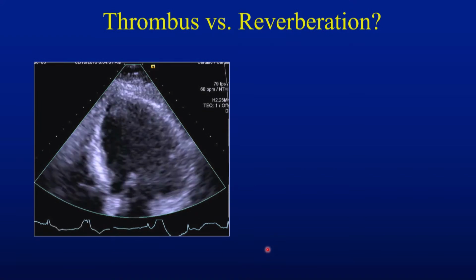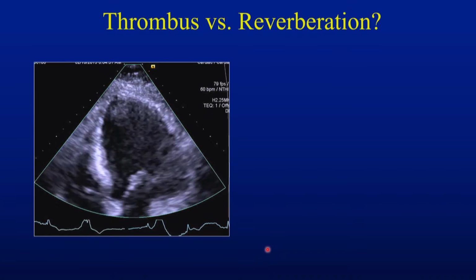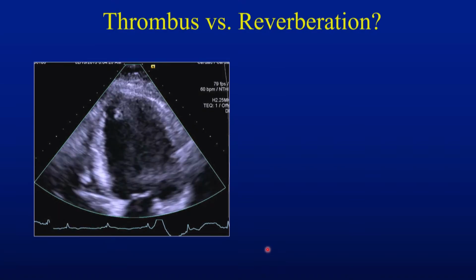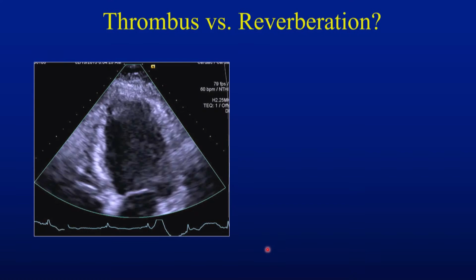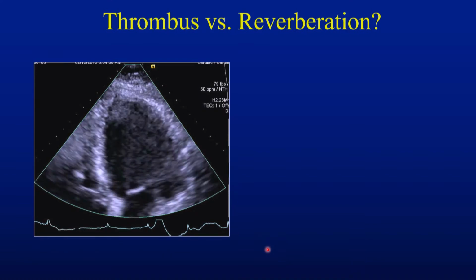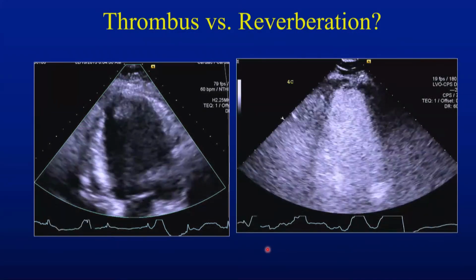Need contrast. Oh, come on. You see this right quadrant that is empty? That's the one. All right, how many thrombus? Raise your hand. Okay, and how many none? Okay, we have about 40% thrombus, I would say. And Dr. Toro doesn't want to commit, although he was a proponent, and he was very vocal before. He's no longer vocal. All right, this is it.